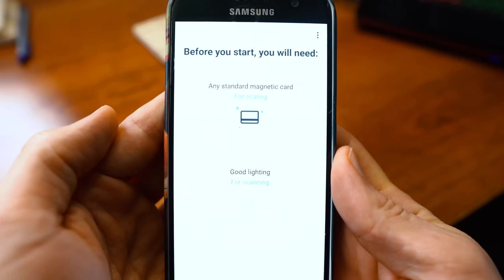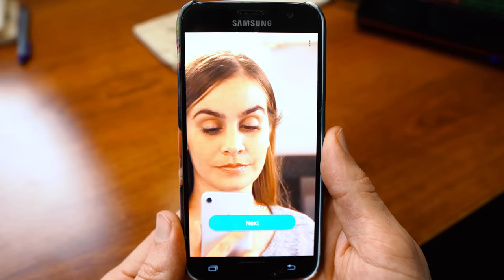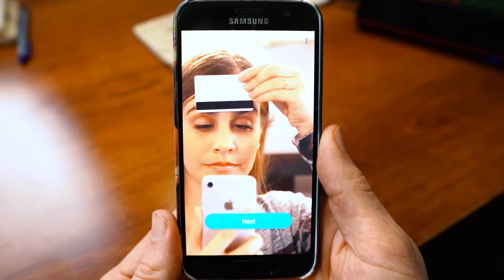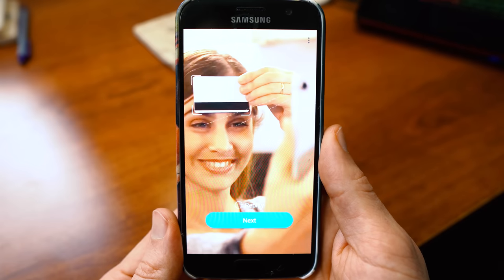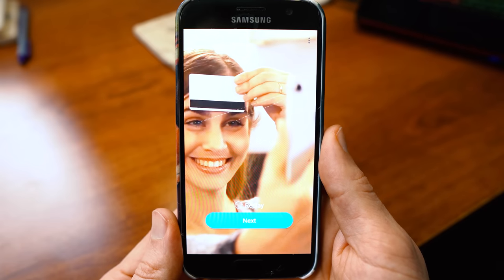Before we start, the app tells you that you're going to need a standard magnetic card for scaling, as well as good lighting so you can take a good picture of your face. I'm just going to use an old outdated credit card of mine. The app walks you through the process with simple instructions. If you are already wearing glasses, make sure to take these off because otherwise it won't take the picture correctly.